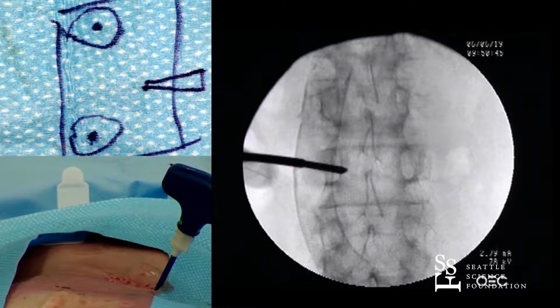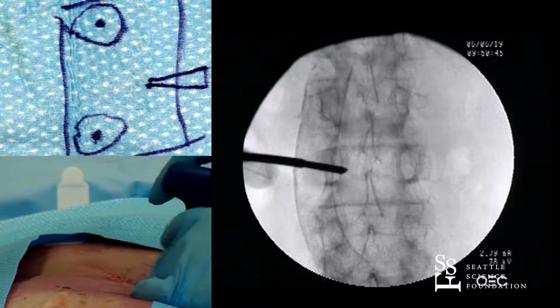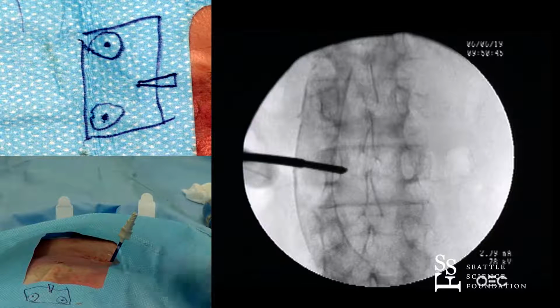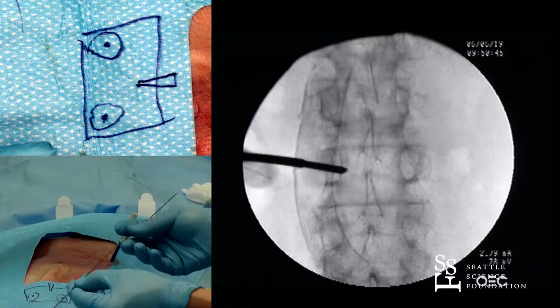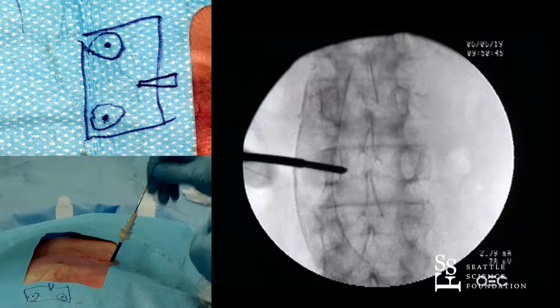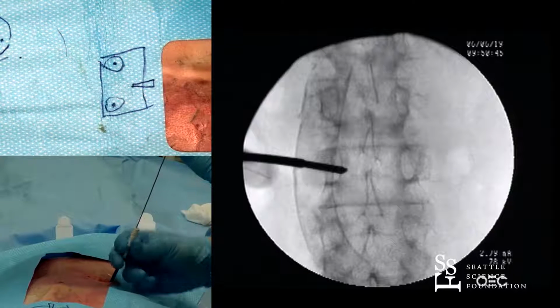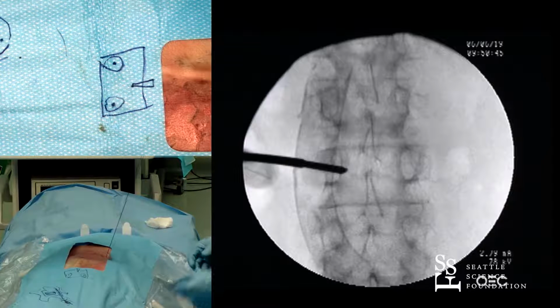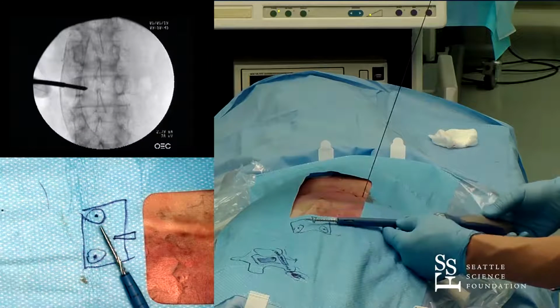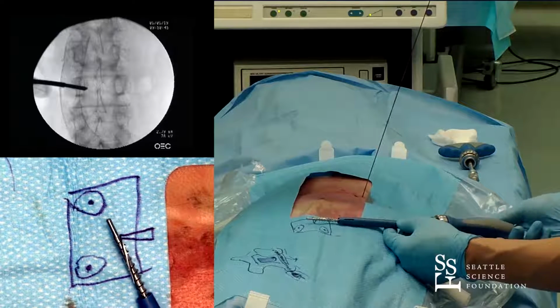Shot. Okay, so we drive it here. I don't know if you can see this system, but we basically take that stylet out. Okay, so I took the stylet out, and then we're going to put a guide wire. Here's the guide wire. And then we'll take this cannula out. Great. And this is our tap. A lot of times we like to prepare the channel that we have, and this is called a tap. This isn't the screw itself, but what it does is that it engages the bone and makes our threads for us.